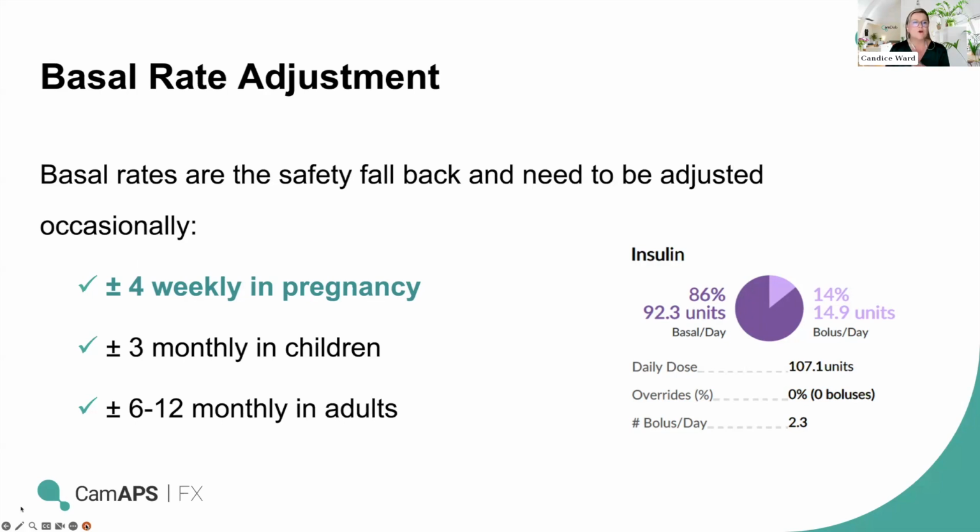So we would just go back to our clinical data and look at that total daily dose, and maybe 50% of that would be equated more or less to what that woman's requirements are, and then just use your clinical acumen to check that out. But do not take the algorithm delivered insulin, because it's significantly helping in the postprandial stage, even if the person is bolusing accurately.